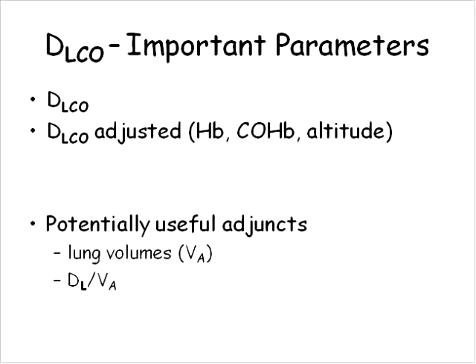In our lab, we follow the ATS-ERS recommendations, and we adjust the predicted value. I know a lot of labs in the U.S. still adjust the measured value, but I think it's more intuitive to adjust the predicted value as recommended by the ATS-ERS guidelines.